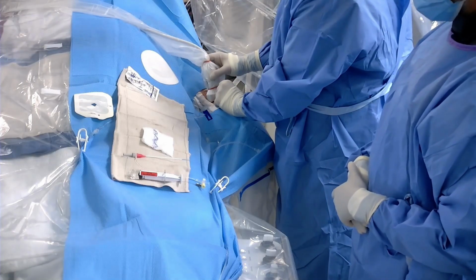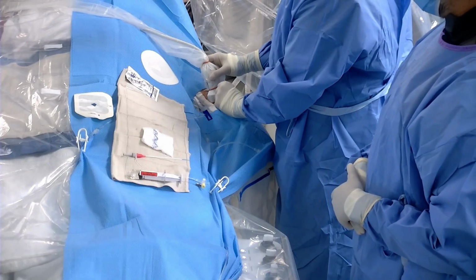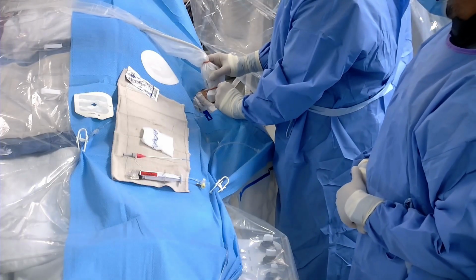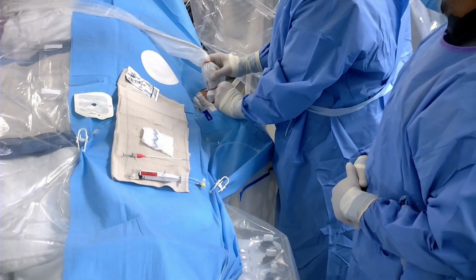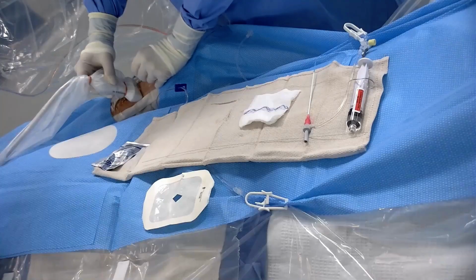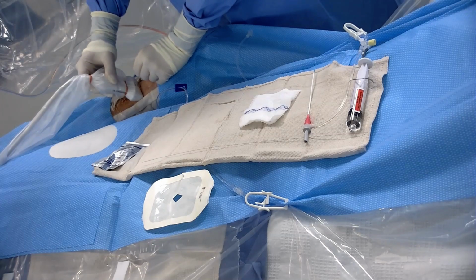And it's also a little bit easier to get into the hypogastric from above, right? It used to somewhat limit what we can place. Like it's a little bit harder to place an Amplatzer plug from the wrist, but it's easier for patient comfort. And then again, like I said, they're going to have to go back into the groin in short order here, to put the limb extension in. So that's kind of why we're doing it.